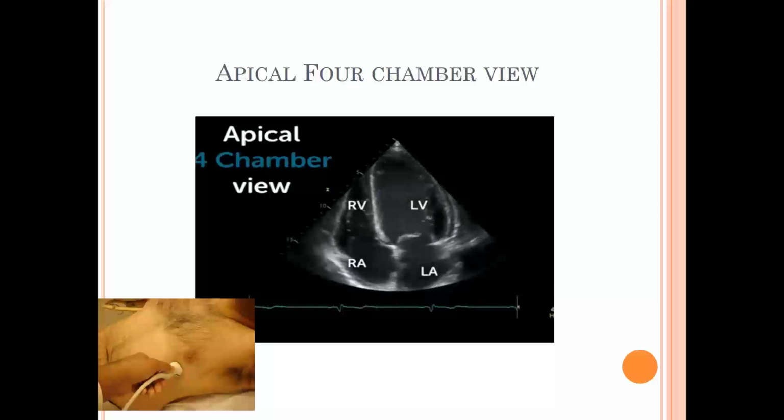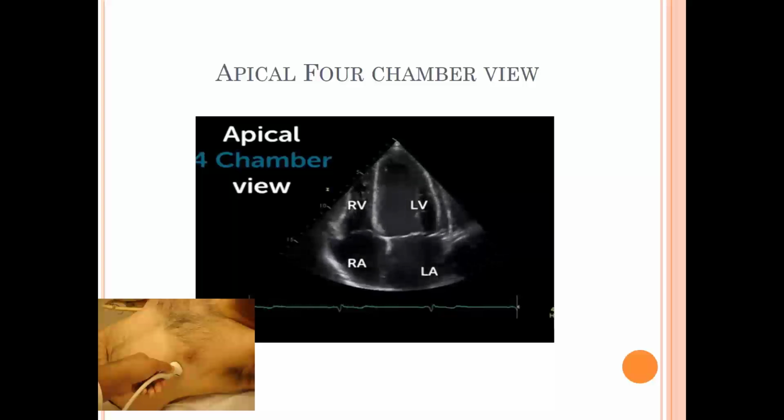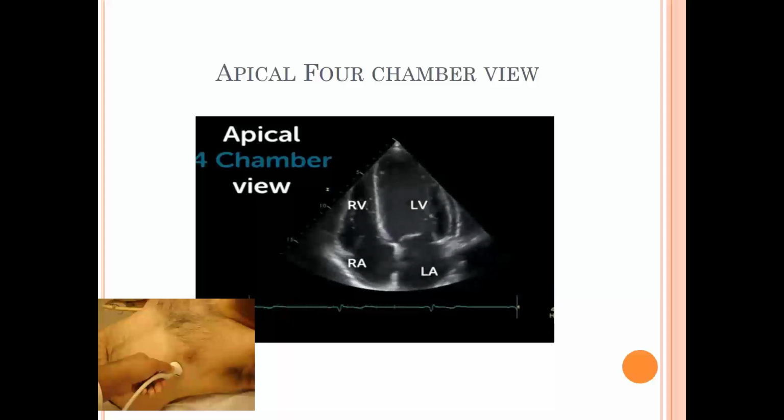We don't comment on the interatrial septum, whether we have a shunt or not, except if we have a T sign, because we might have a false ASD here. We comment on the right ventricular functions, the measurements of the right ventricle, and the TAPSE and the Doppler.